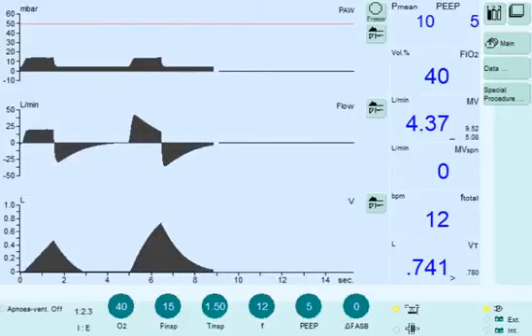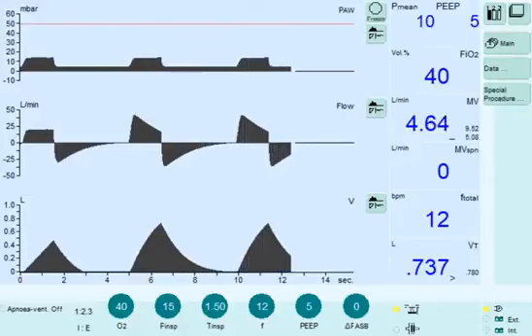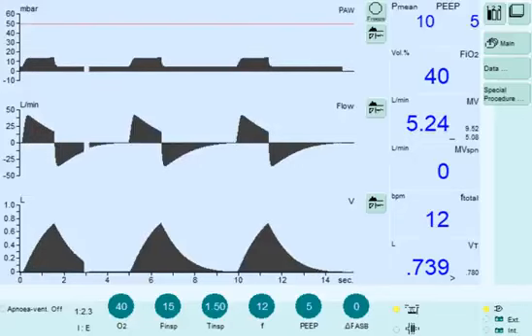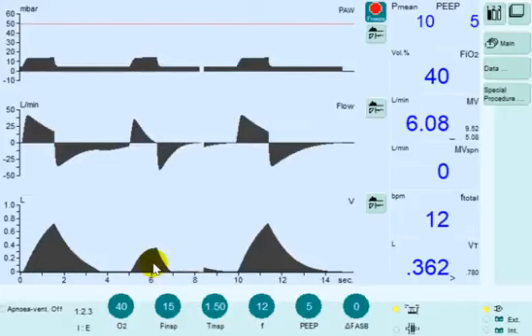Now let's decrease the compliance and see the difference. So if the compliance is decreased, the same pressure results in a lower tidal volume, which is similar to the case of increased resistance.